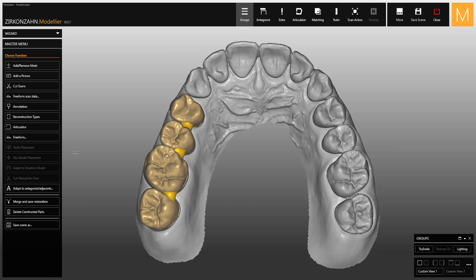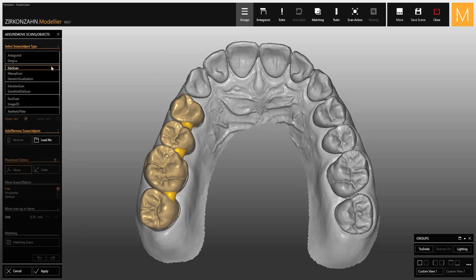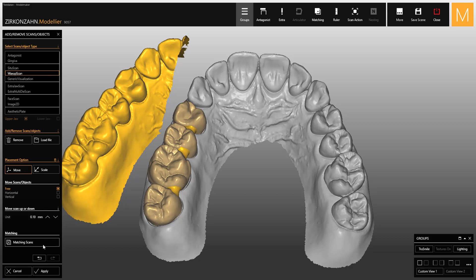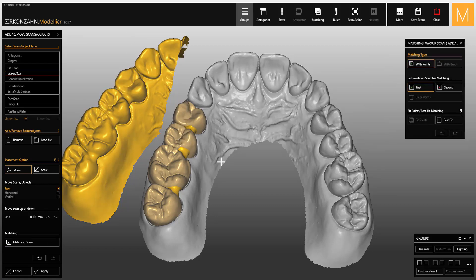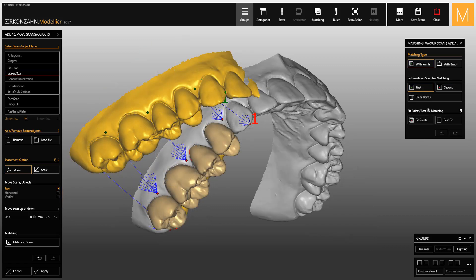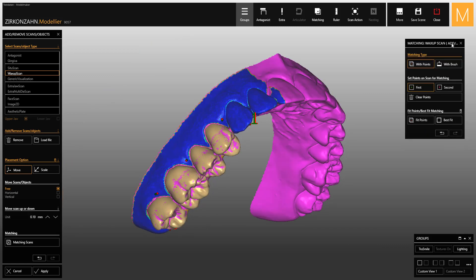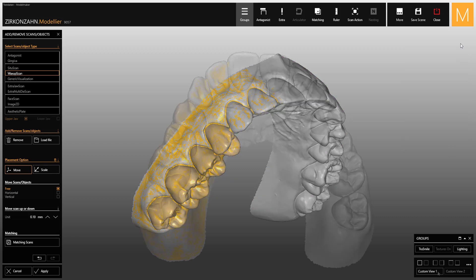Then go to 'Add/Remove Mesh' to import the scanned or designed wax-up. Choose the correct file from the folder and click Open. Once the importation process is completed, proceed with the matching by placing the matching points, then click on 'Fit Points' and 'Best Fit'.